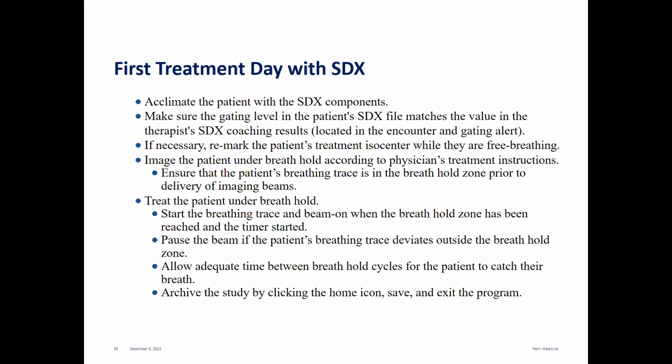Ensure that the patient's breathing track is within the breath hold zone prior to the delivery of the imaging beams. You always want to make sure their breath hold is in the green bar. I always tell them to go up slowly and hold it in the middle of the green bar, and that the timer has started. Treat the patient under breath hold.